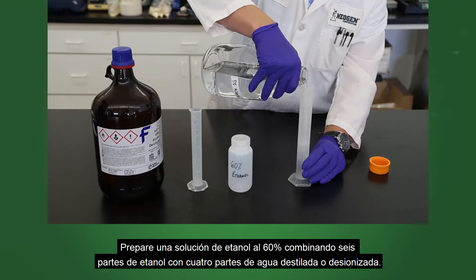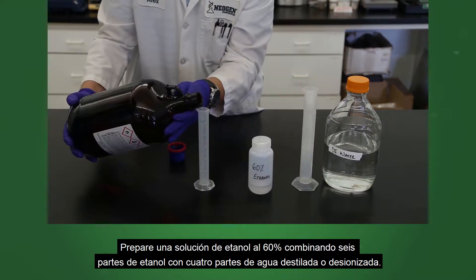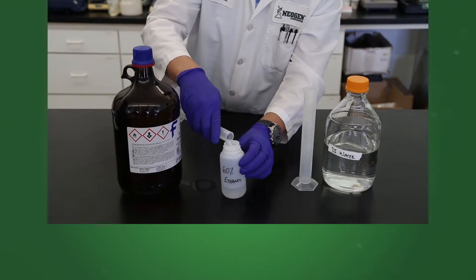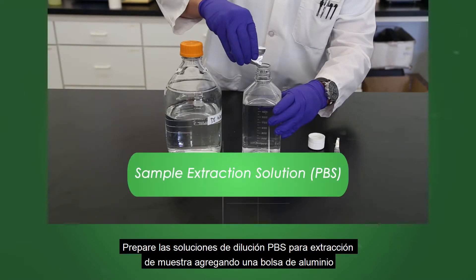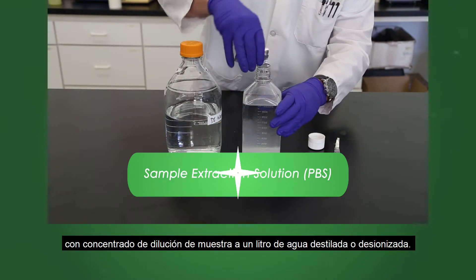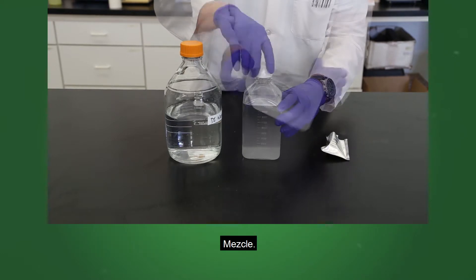Prepare a 60% ethanol solution by combining four parts distilled or deionized water with six parts ethanol. Prepare the PBS sample extract dilution solution by adding a foil pouch of sample dilution concentrate to one liter of distilled or deionized water. Mix.